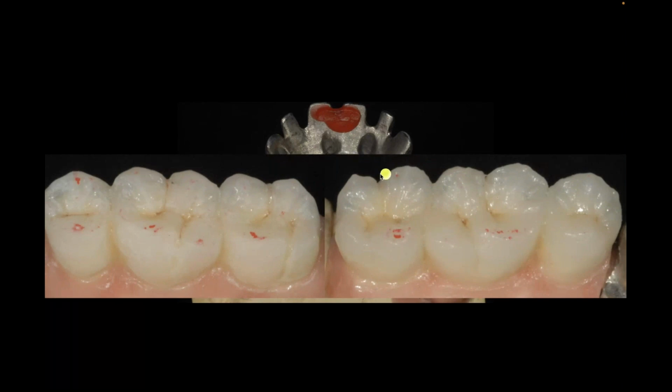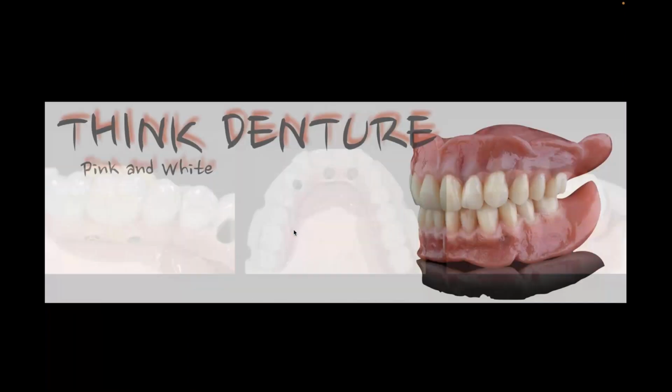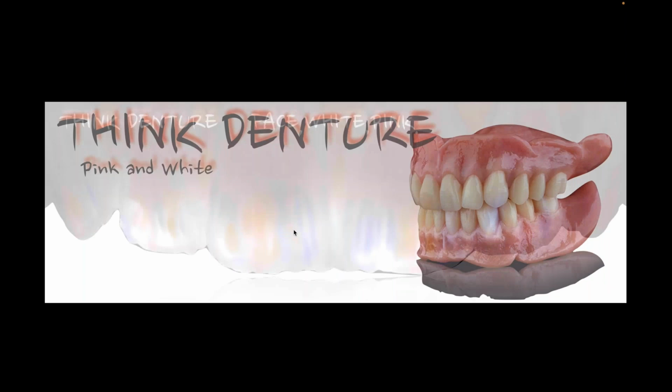So I'm going to flatten out those cusps. I'm going to change those angles. I'm going to keep redefining this until I get nothing but a dot in my occlusal scheme. And then when I have it, I can polish up and finish. So yes, I think like a denture across the board, even in crown and bridge world.